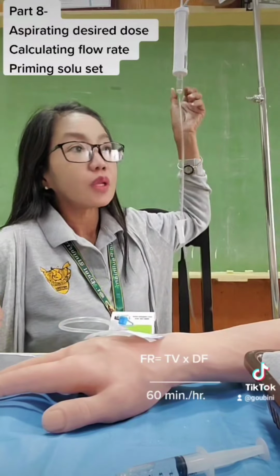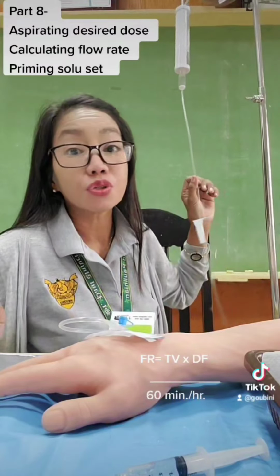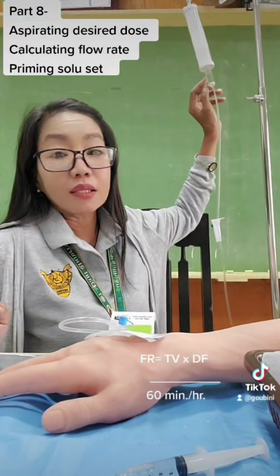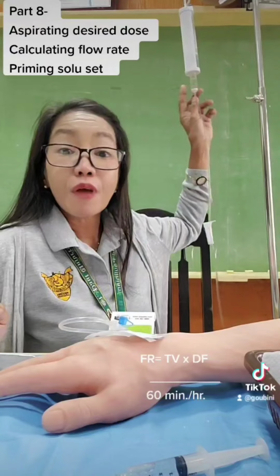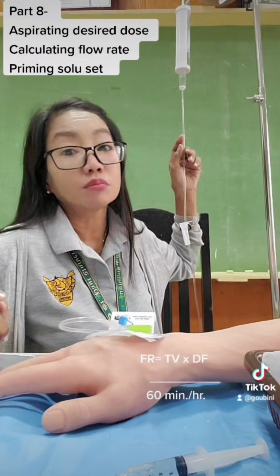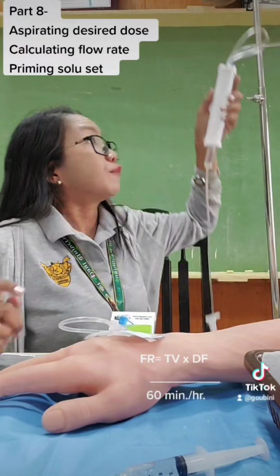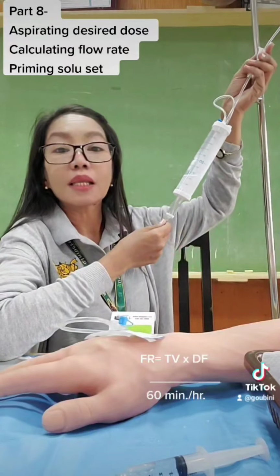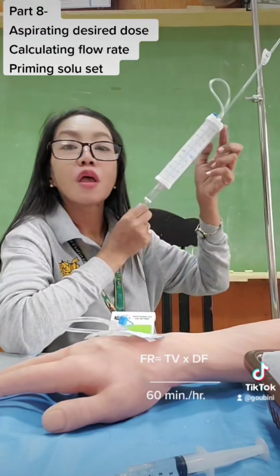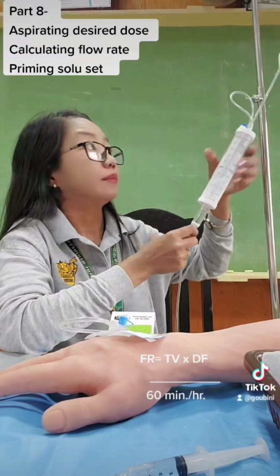So we have to multiply this with the drop factor. Since it's a micro drip, this is a needle in this chamber, the drop factor is 60 drops per ml. So we will infuse here by opening this regulator and filling this up with your NSS solution until it reaches 50.